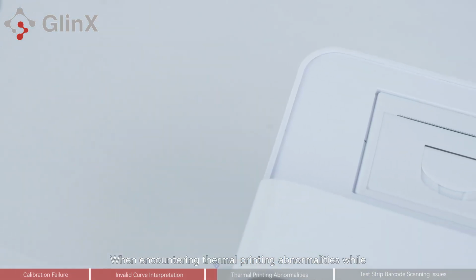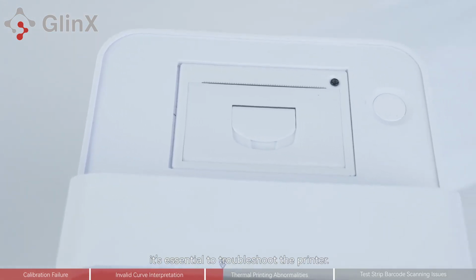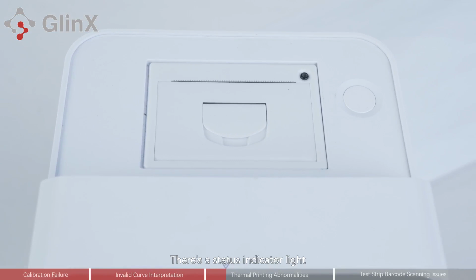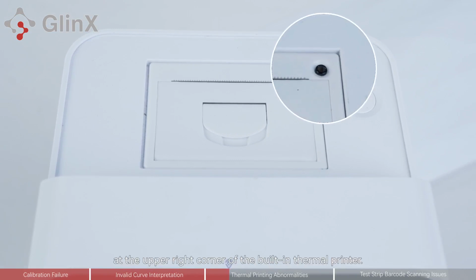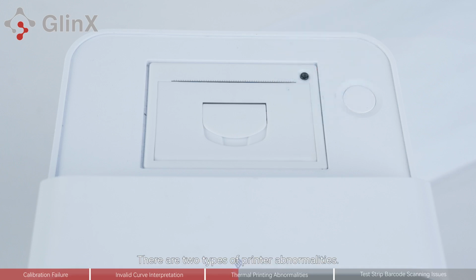When encountering thermal printing abnormalities while using the fluorescence analyzer, it's essential to troubleshoot the printer. There is a status indicator light at the upper right corner of the built-in thermal printer. Under normal conditions, this light flashes red. There are two types of printer abnormalities. 1. Thermal printing paper is depleted.